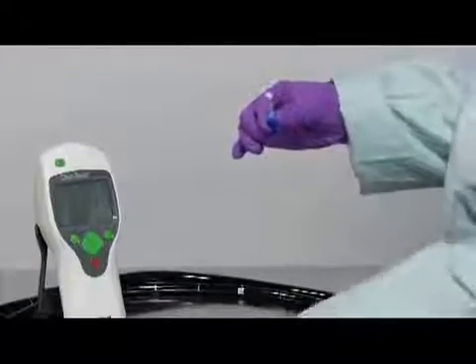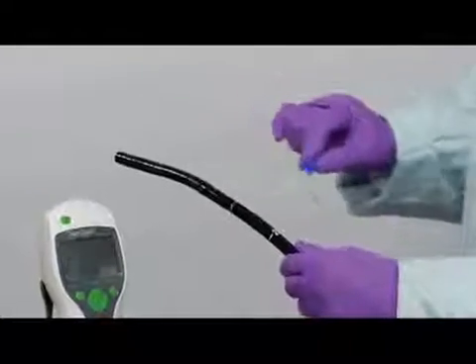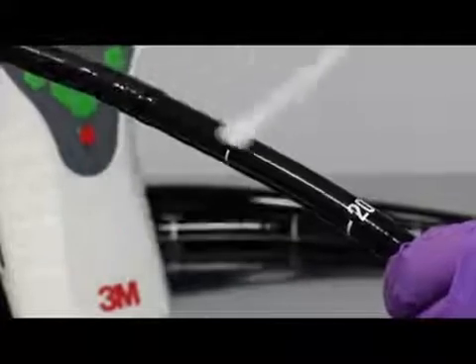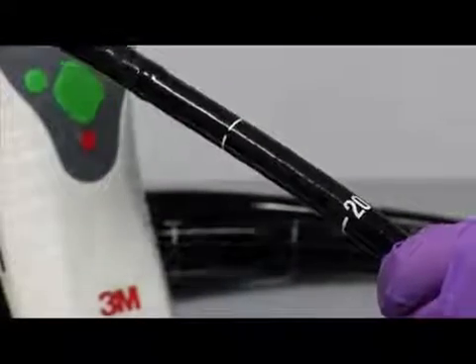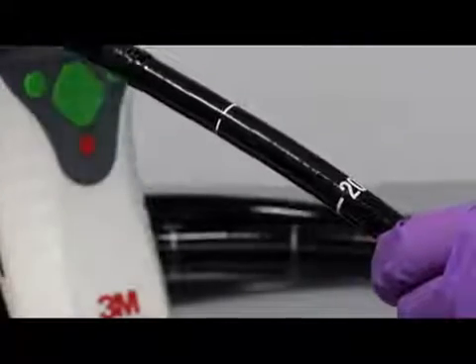So you take a surface swab, and starting from the 20 or the 10 mark, you're going to swab the surfaces. Again, make sure that your swab is bending and that you're twirling the swab and that all surfaces have been tested.